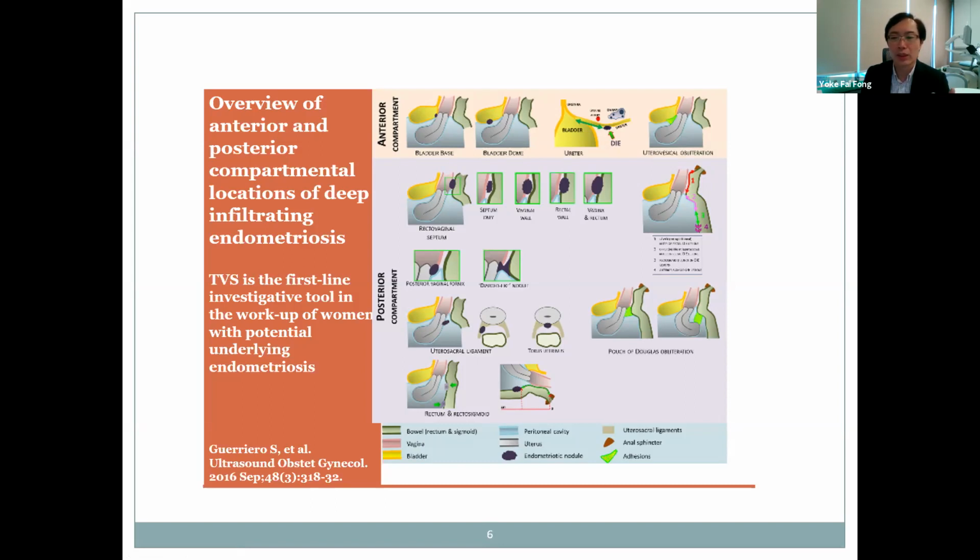We know that endometriosis is mainly concentrated in the pelvis. So of course, in terms of viewing the large intestine, we won't be as good as the MRI, which can see across your transverse and to your ascending colon. We can probably only see up to the sigmoid colon, but I think that's generally very good and is good enough for endometriosis. We also need to look at the posterior fornix and so on.